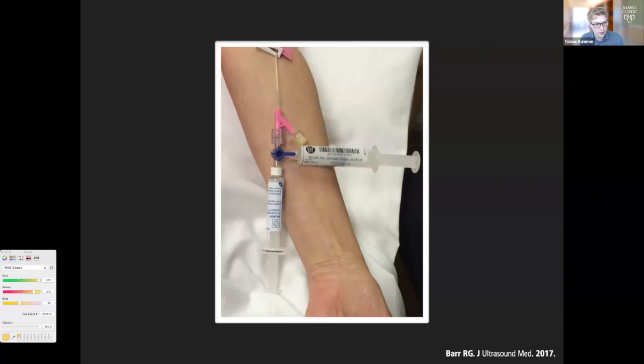I can tell you that we have had situations where we used it without the flush, because it takes some maneuvering in traumas with a 3-way stopcock. It does work. The flush usually gives the contrast a little bit extra boost. Also, for who's interested, we're publishing this right now. We have used it through an IO, and it does work through an IO.